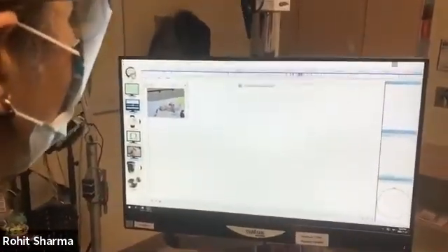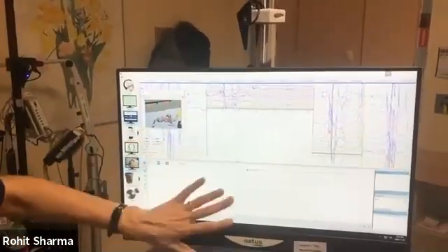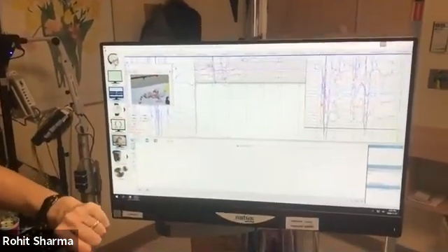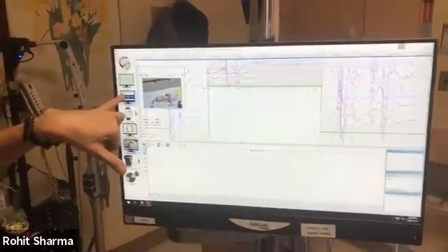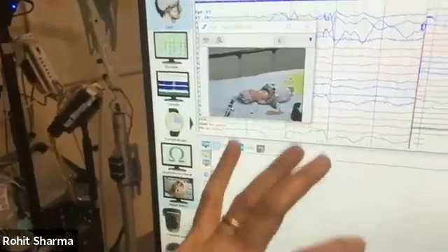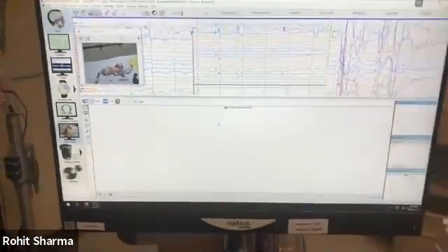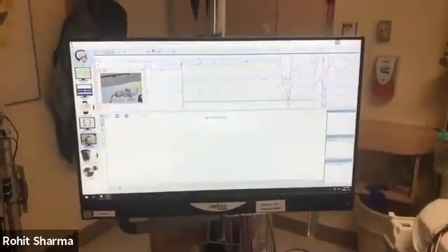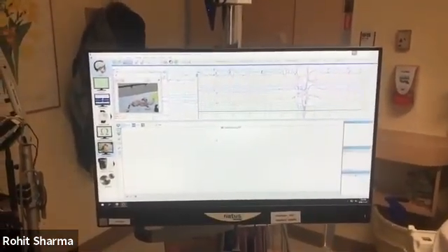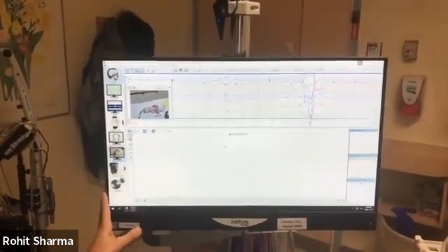So I'm just getting the machine started back again. And you notice that there was just one window on the machine. We didn't have the bottom window, which showed the amplitude integrated EEG. So you would go to trends and click on that and minimize the window to the size you want. And you notice that the recording has already started on its own. We didn't have to do too much. This is one of the good things about this monitor, is that it's able to restart and it'll keep all the data that's recorded.